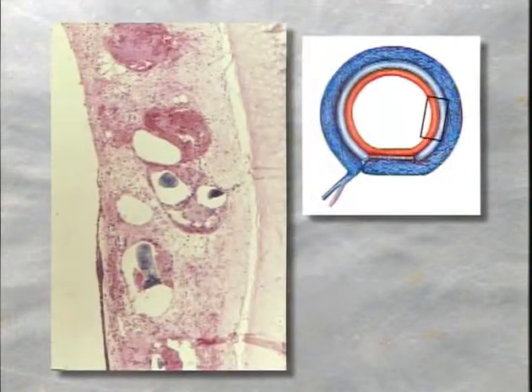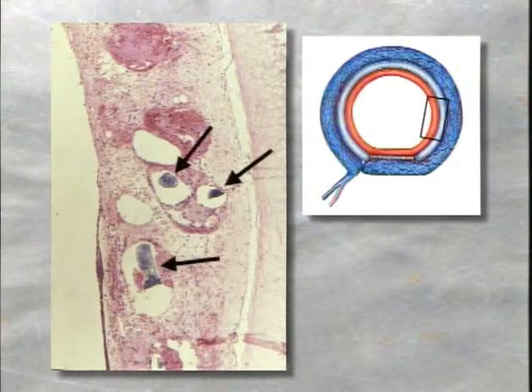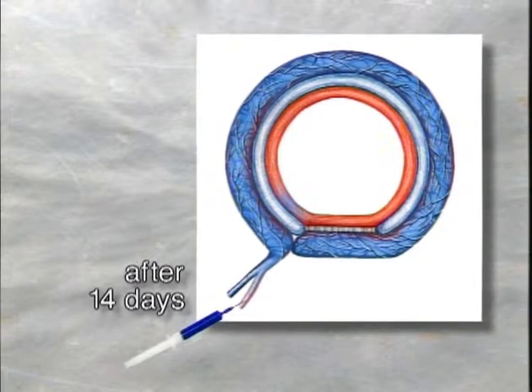The first signs of revascularization can be seen on an axial histological section after 5 days of fascial wrapping. The blue spots inside the thrombosed vessels are the first signs of mucosal reperfusion. Squamous epithelium is visible on top of the partially perfused mucosa. Full mucosal revascularization is obtained after 14 days of heterotopical revascularization. The mucosal lining is blue-colored after blue silicone injection of the vascular pedicle.